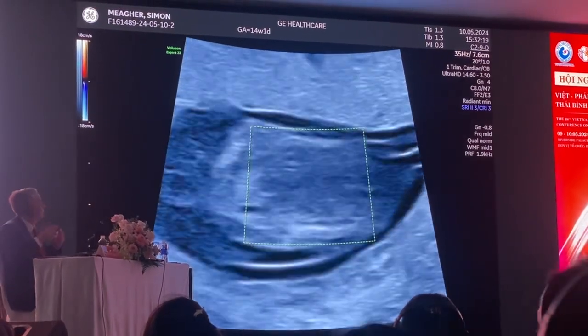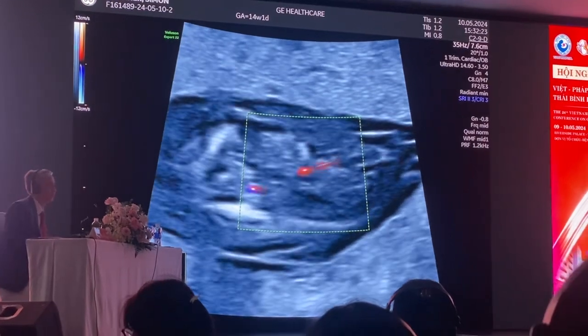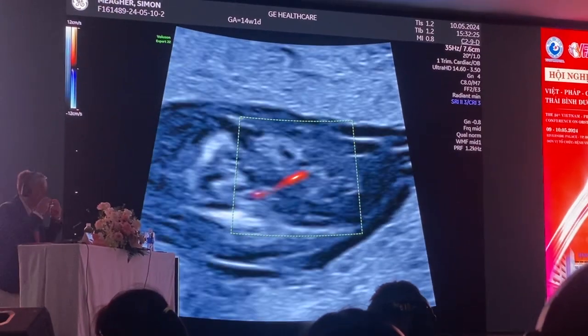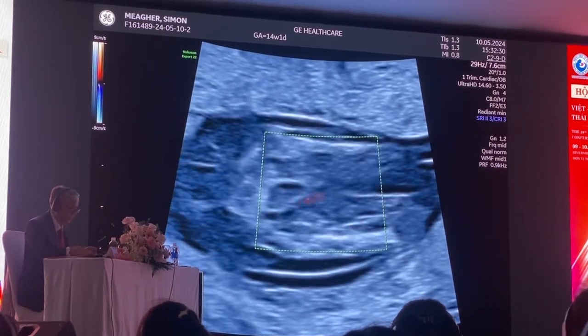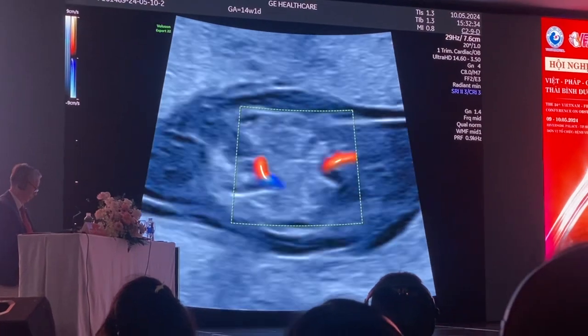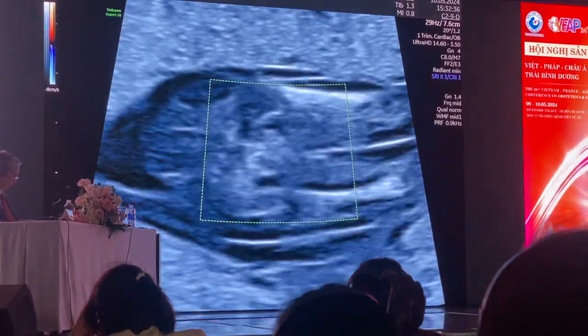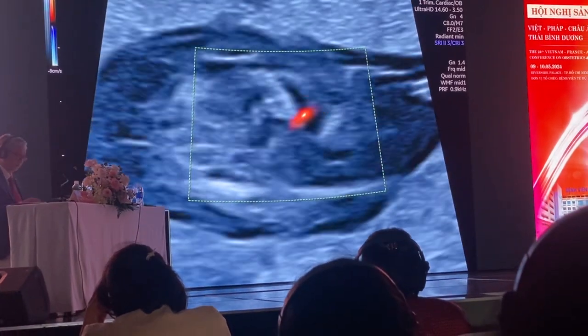Arteries, the umbilical artery. So the umbilical artery, I have a PRF of 18. I need to reduce the umbilical artery PRF, and I need to increase the gain. When I'm looking at it, I can see that the bladder is present, but I'm only seeing one umbilical artery. Now, my question when I only see one umbilical artery is maybe because I do not have the right angle in which I'm seeing the artery.